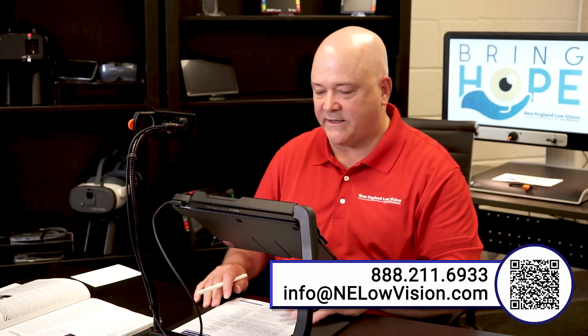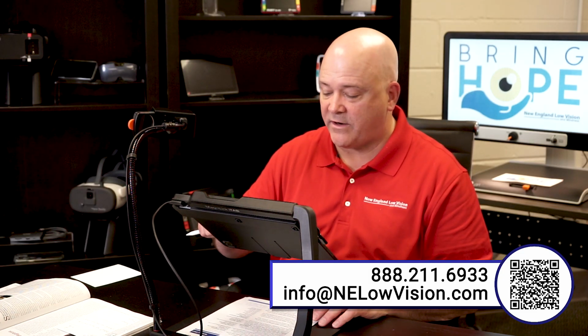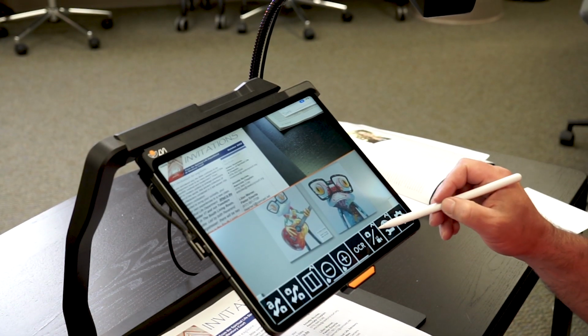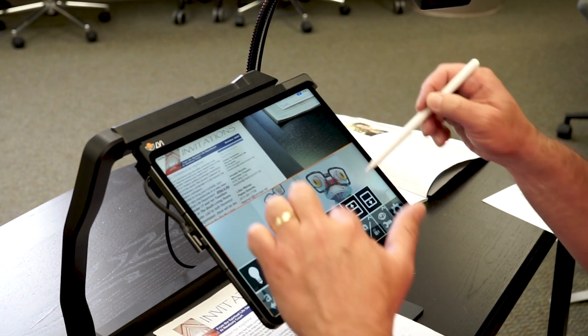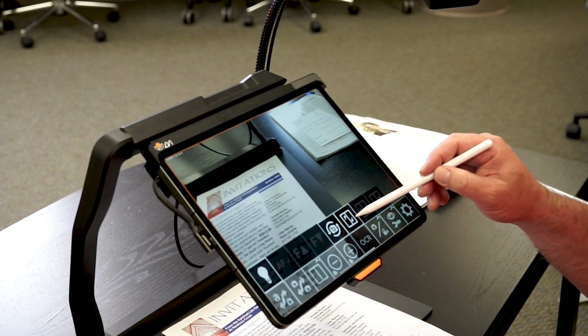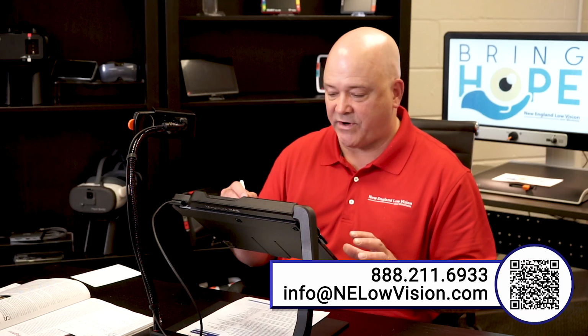So now I'm angling the screen a little bit differently. Let's say I wanted to show more of the near and less of the distance. I can easily change it. Or I can cycle through the different options by just tapping this button. So now we have it on top and bottom. Now we have it right on left, bottom and top, left and right, full screen, the other full screen, and back to our split screen again.